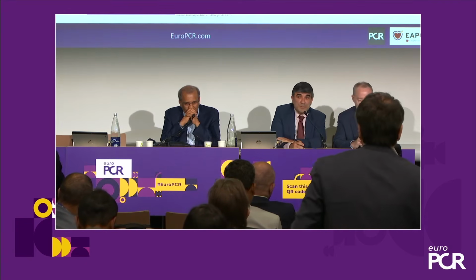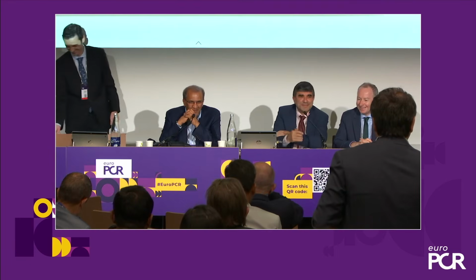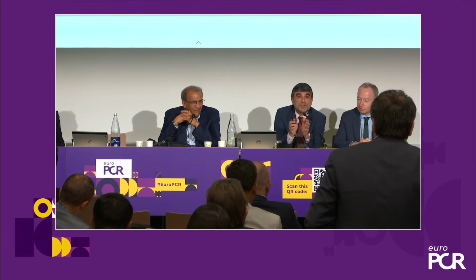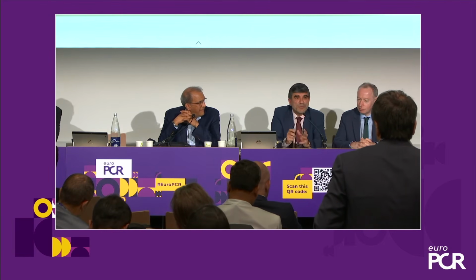Thank you, Alfonso. Great presentation. As you gathered, Alfonso supports Barcelona, I think. Right? Anyway, I think there's a few things here just for the audience. When we talk about the pulses, this is what the machine will give you, how many pulses you delivered. Often it's probably not as important. It's about treating the lesion.